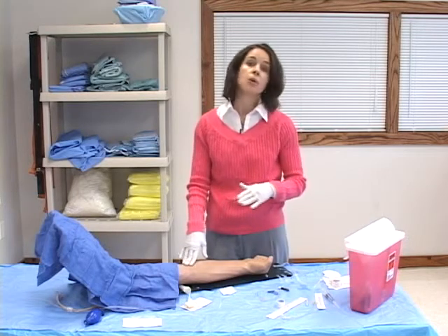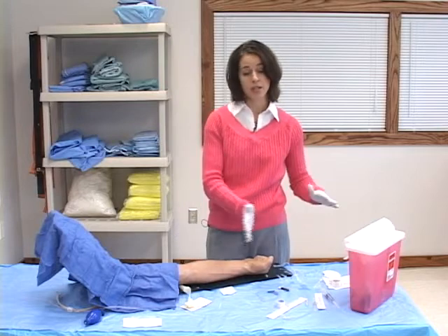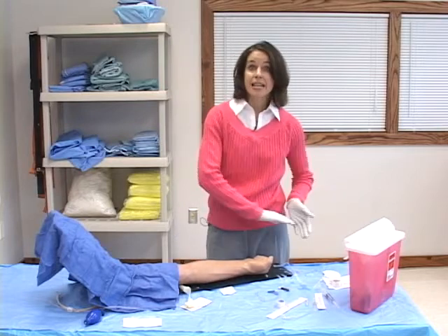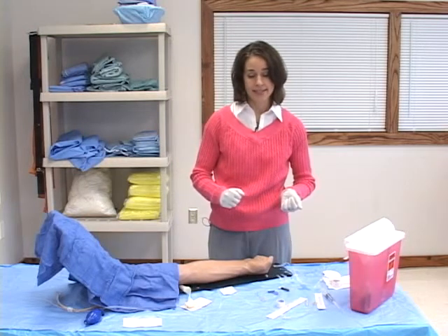So you don't want to ruin a vein that would be good long-term IV access. So I often will start distally and move proximally as I'm trying to obtain my IV access.